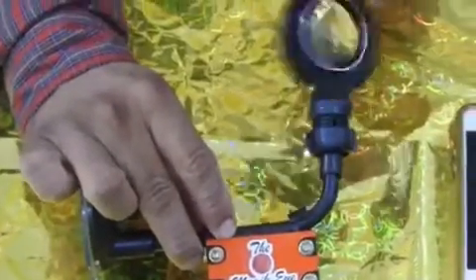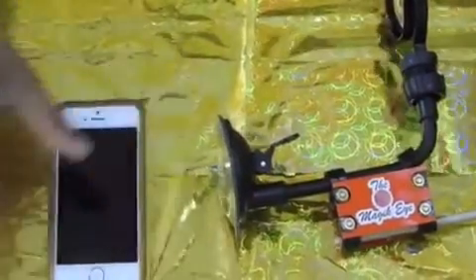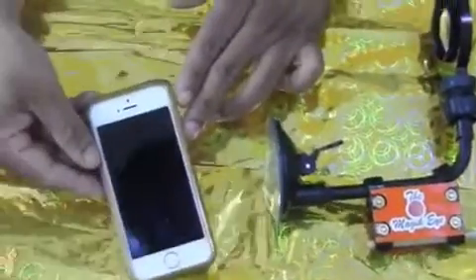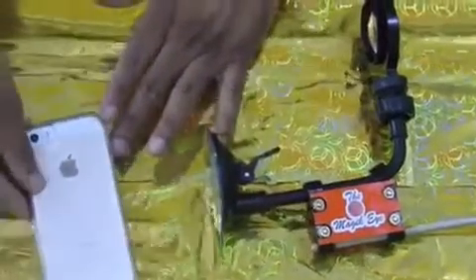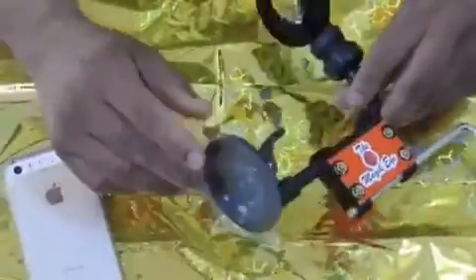Now our lens is ready for use. The back panel of the smartphone is attached to the device by the suction mechanism of the suction cup, which is the suction cup of the device.